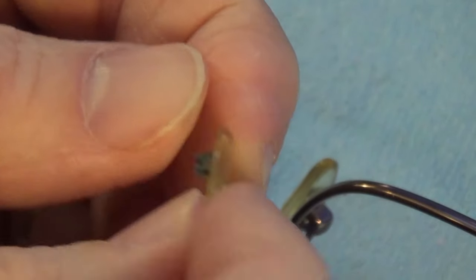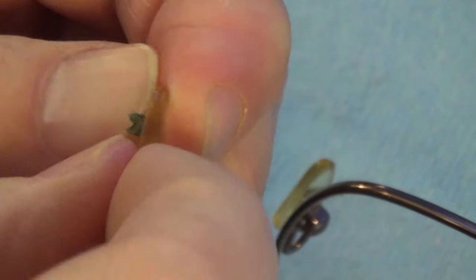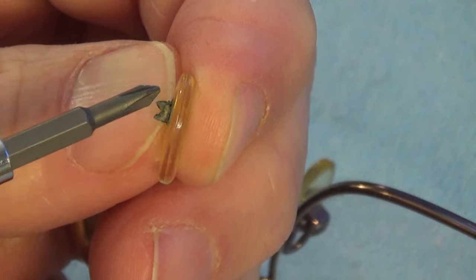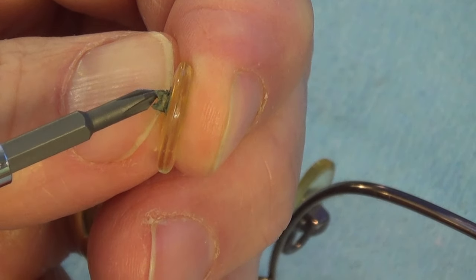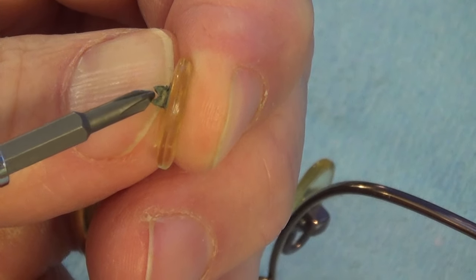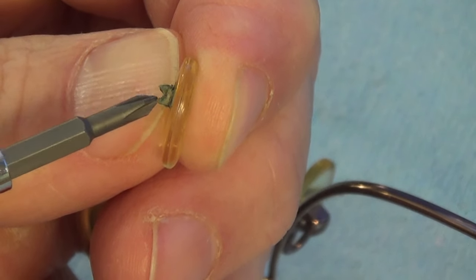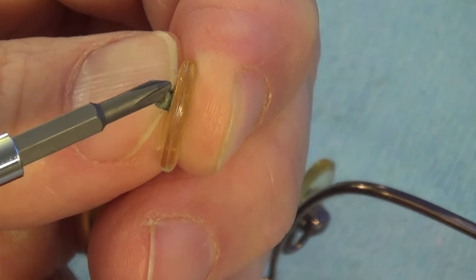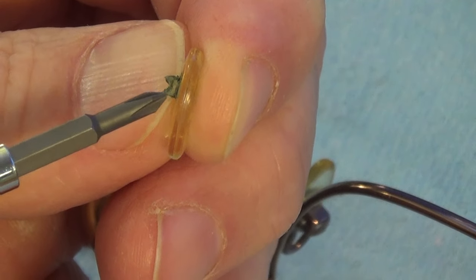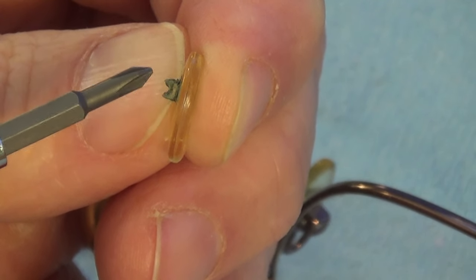Looking closer at the nose pad that fell off, you can see where it connected to the glasses. This is the pad side, and in the back there's a little metal part in a U-shape. That U-shape should have been round — a round hole where a screw inserts — but over time it degraded and eventually broke off. Some nose pads have a silicone or rubber ring which are even more prone to breaking. This one had a metallic ring but it eventually broke off and needs to be replaced.